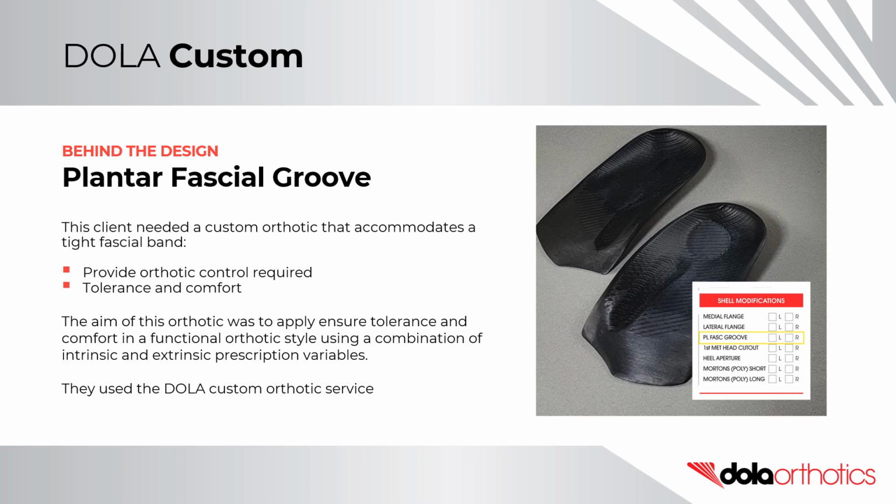The aim of this orthotic was to ensure tolerance and comfort in a functional orthotic style using a combination of intrinsic and extrinsic prescription variables. They used the DOLA Custom Orthotic service.